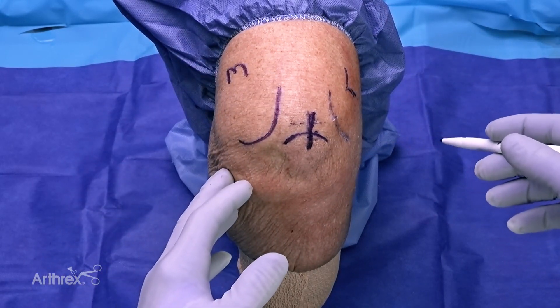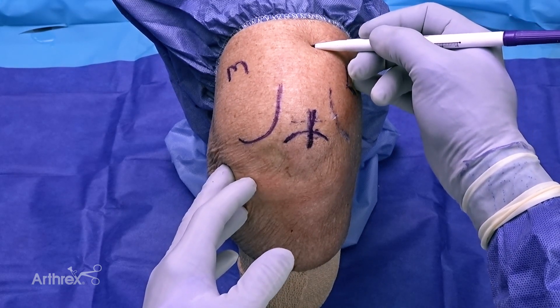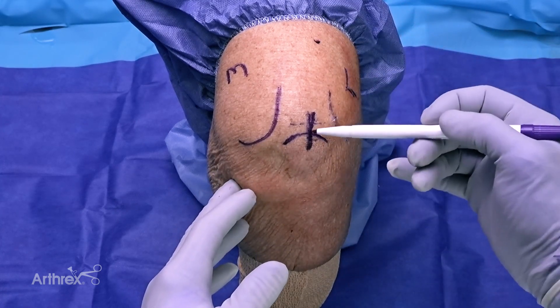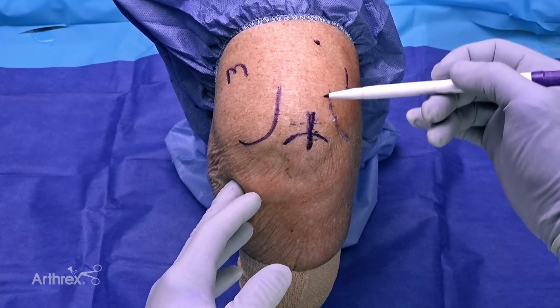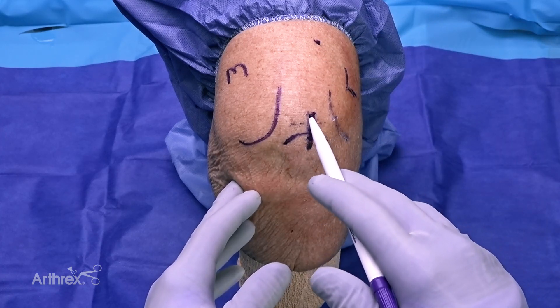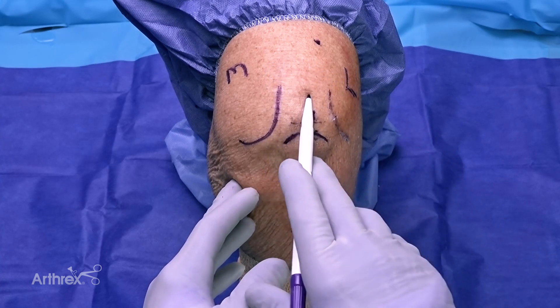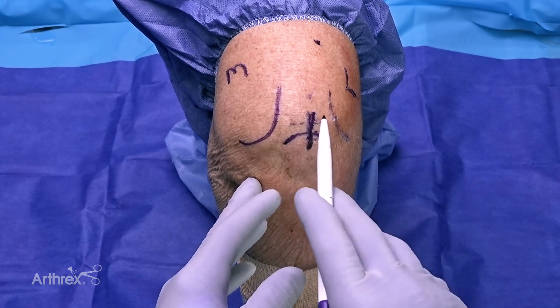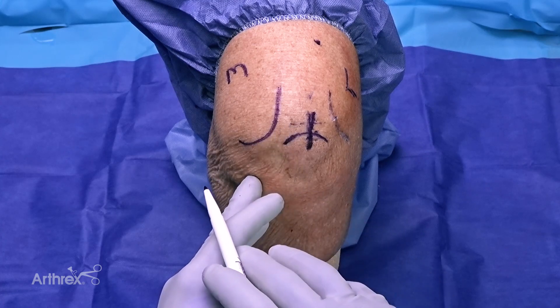Once intra-op and ready to harvest the quad, I always make a mark around the 70 millimeter mark. This serves two purposes: it gives a topographic reminder of where I am so I don't go too far, and it gives an aiming point. Looking at the leg, your tendency would be to go straight up, but the quad tendon fibers are actually angled. This is a visual cue for staff and myself of where to aim when harvesting, whether doing bone quad tendon or soft tissue alone.